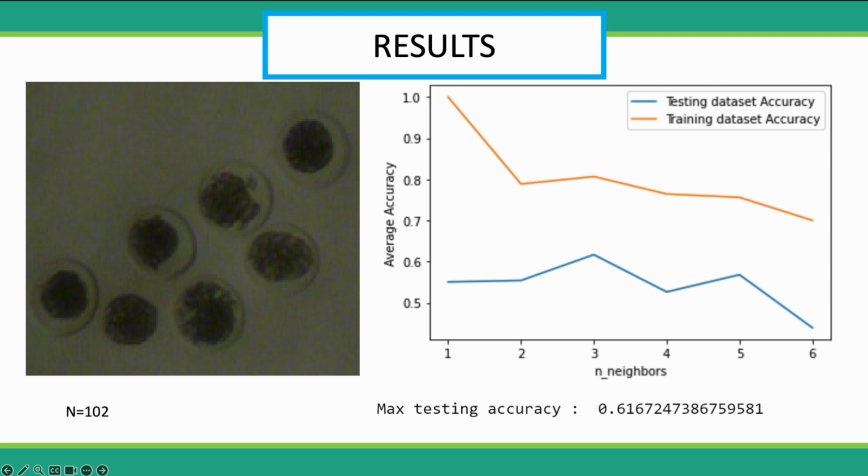Two years ago, we did our first sex selection study. This involved 102 embryos recorded on a 12-year-old Nikon Coolpix camera. We calculated the mean pixel change, or morphokinetic activity, of embryos that were known to produce either a bull or heifer calf. We realized, based on the mean pixel change, the male and female embryos tended to cluster together.